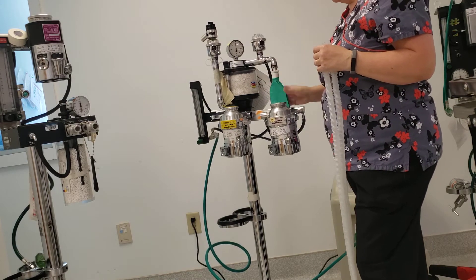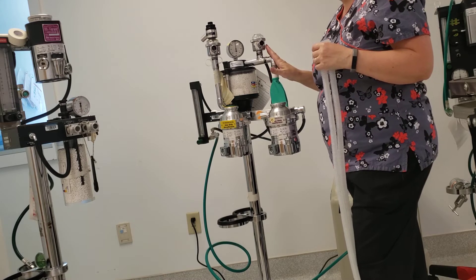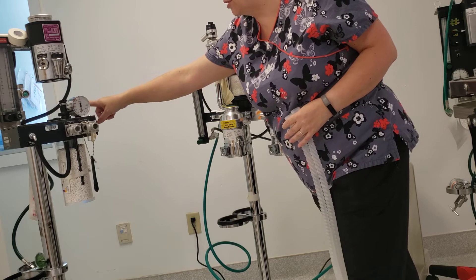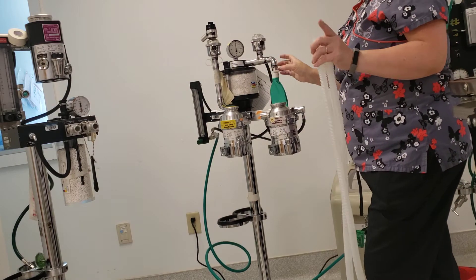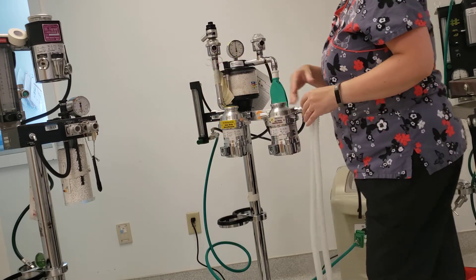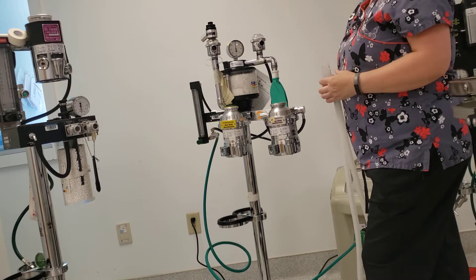The reservoir bag or breathing bag hooks to the support on this particular machine. This machine has a port off to the side where your scavenger attaches — that can look a bit tricky — but this goes to your scavenger, and here's where your breathing bag goes. They can be located in slightly different spots, but every machine has one.